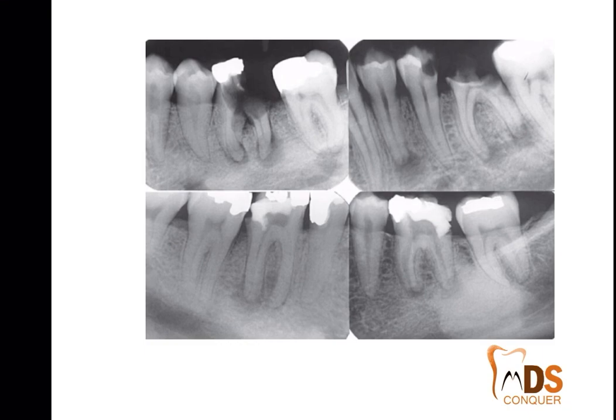Whenever a radiograph is given, draw your 4 steps. First one, localize, give your locality. Second, periphery. Third is the internal structure. Fourth is the effect on the surrounding structures. If you go via all these 4 steps, you can simply arrive at your diagnosis.